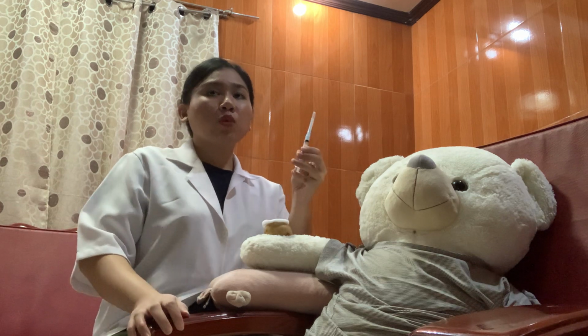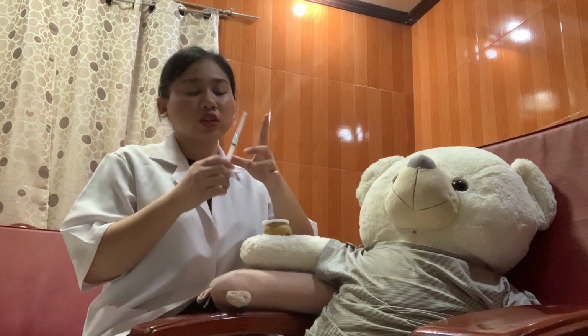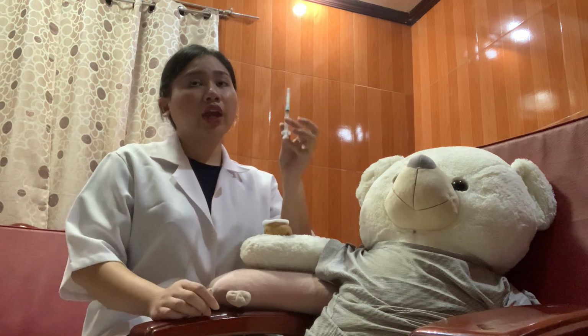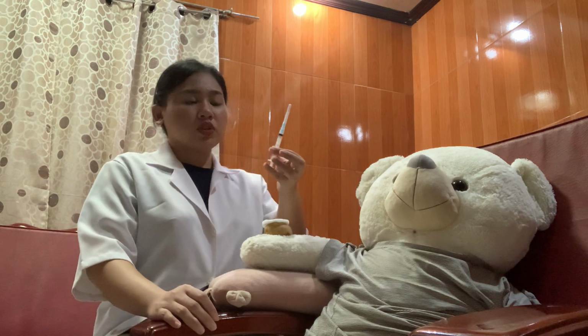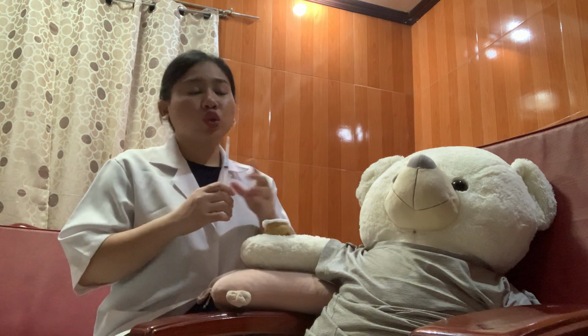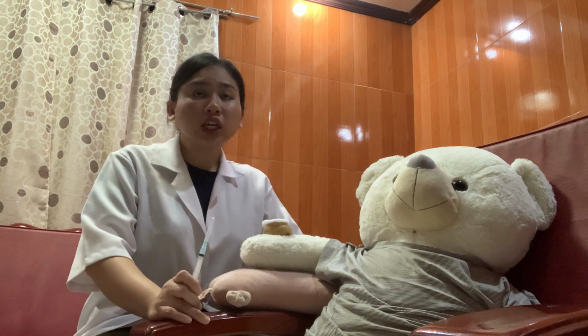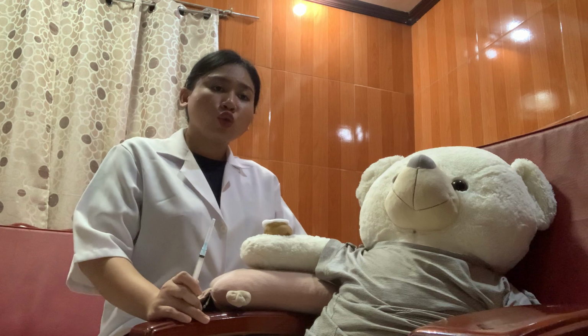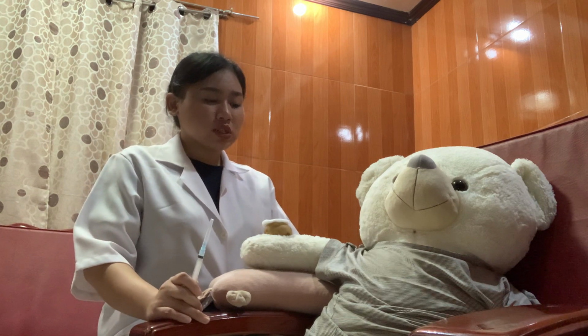The air bubbles may alter the laboratory test results, so it is very important to keep it airtight to prevent alteration of the result. The use of ice reduces the temperature of the sample and also slows the metabolism of the oxygen.